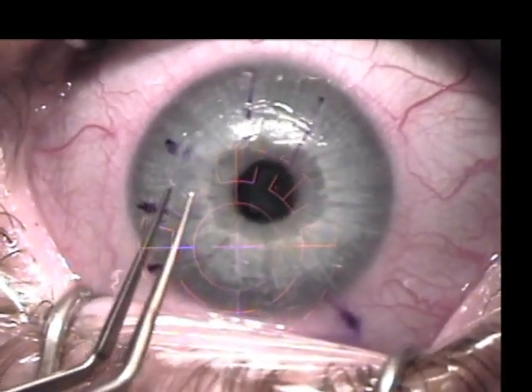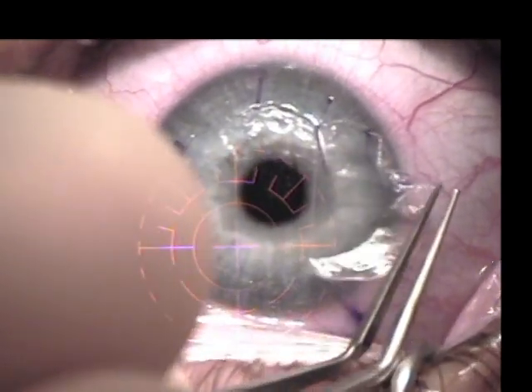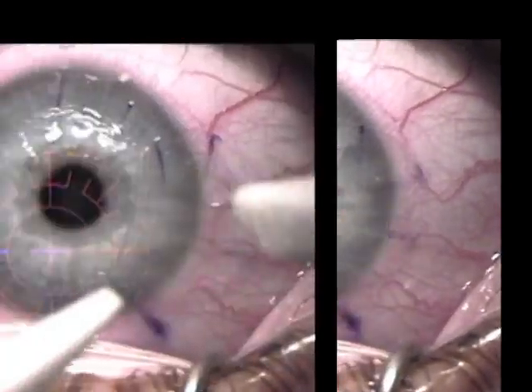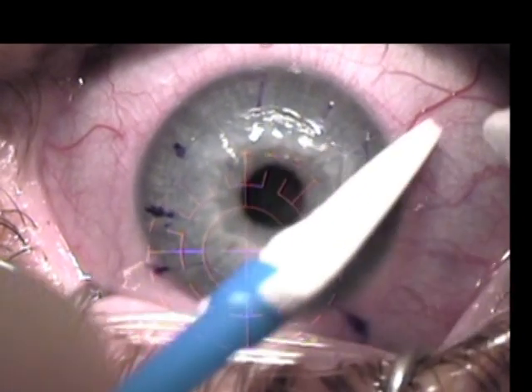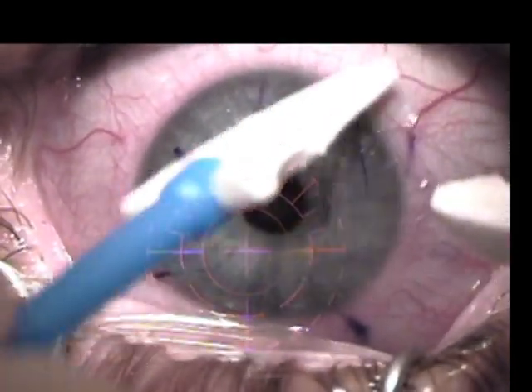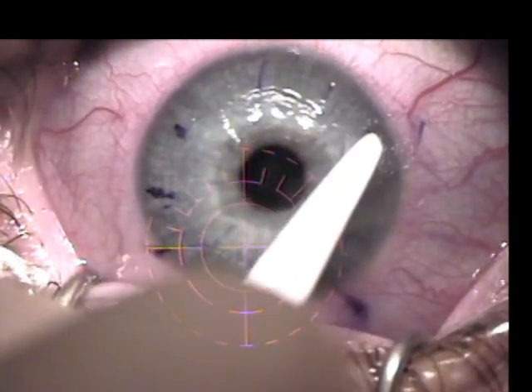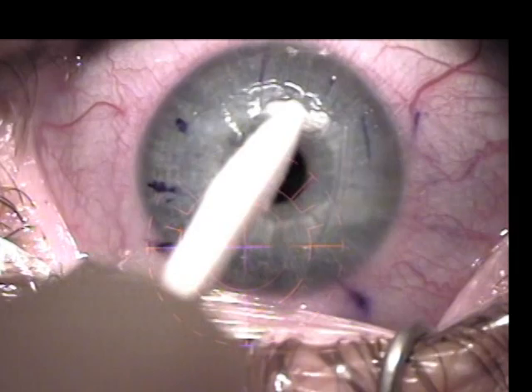A toothless forcep is then used to retract the flap. Lint-free Maricel sponges are used to remove any epithelium on the posterior aspect of the flap. The same process is used to remove epithelium from the stromal bed.